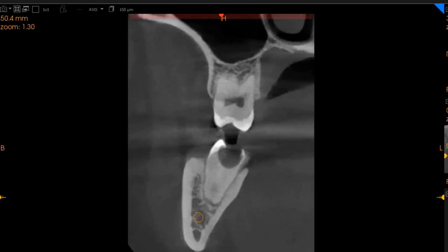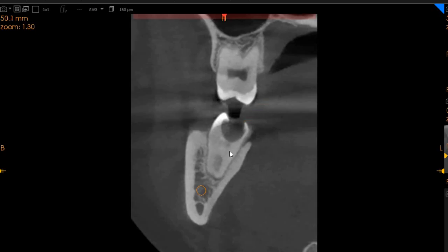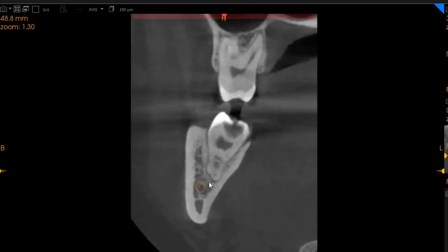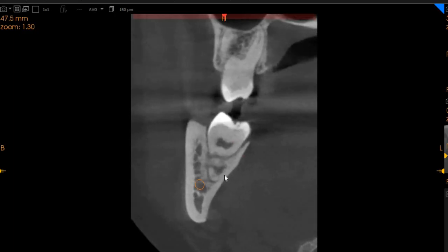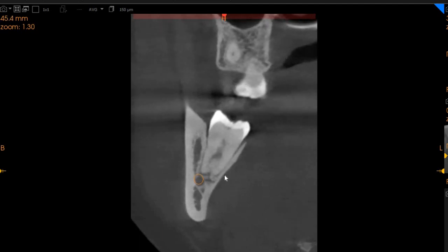This is the transaxial view, basically the proximal view. You can see there is a very big cavitated lesion in the tooth — a crusty carious tooth involving the nerve right there. At the apex of the mesial root, which you can see right here, the nerve is relatively far away. The tooth is lingually positioned and the nerve is buccally positioned.